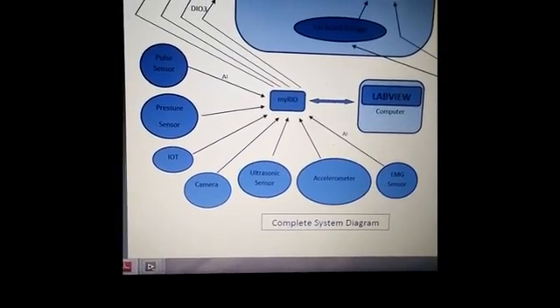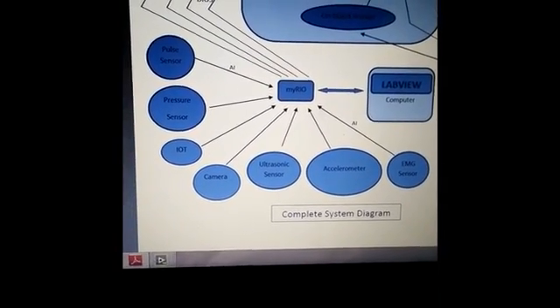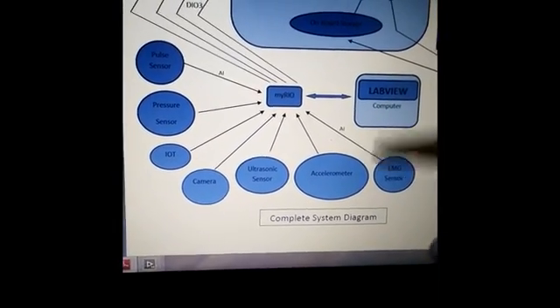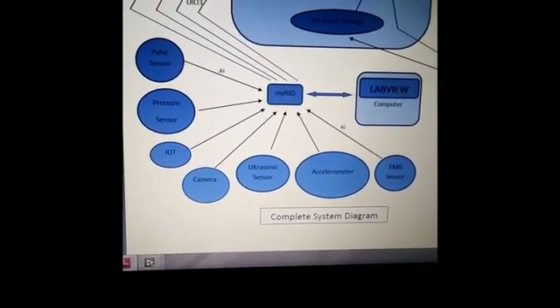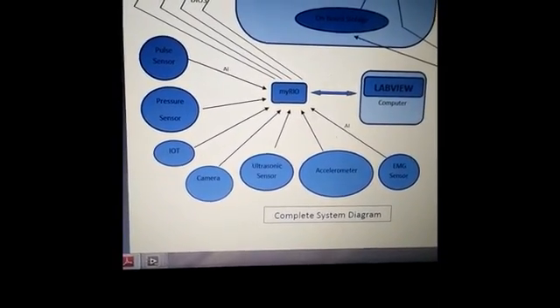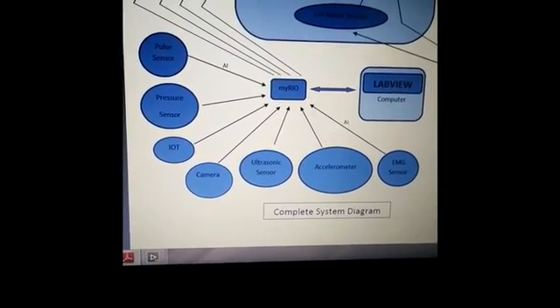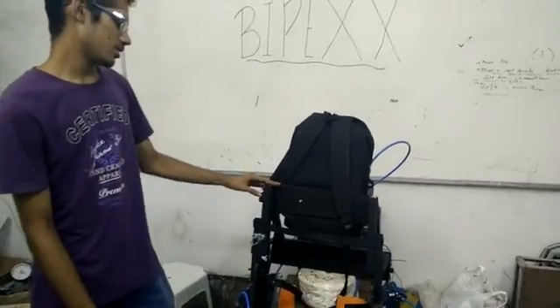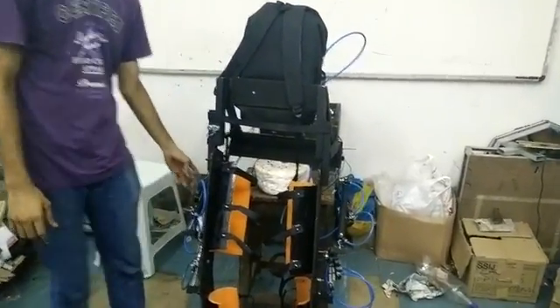The accelerometer gives acceleration along all three axes. If there is some mechanical error, that can be deduced using the accelerometer. The EMG sensors are placed on the leg of the patient. EMG stands for electromyography, and the EMG sensors give a plot of the muscle movement of the patient. Now we'll see the design and the working of the biped exoskeleton. The major components used here are the external framework, the pistons, and the solenoids.